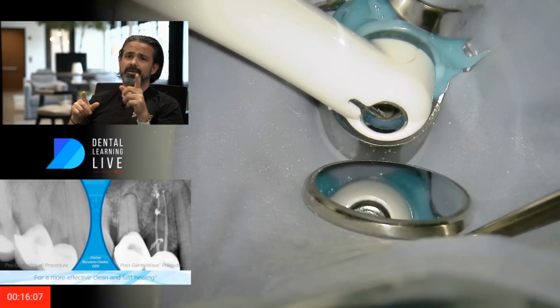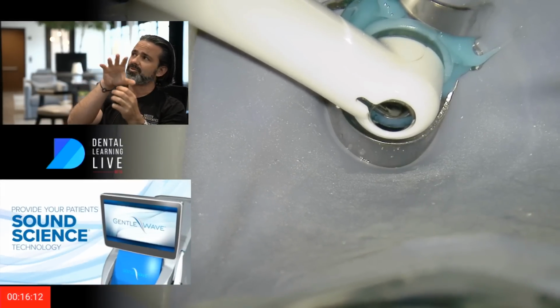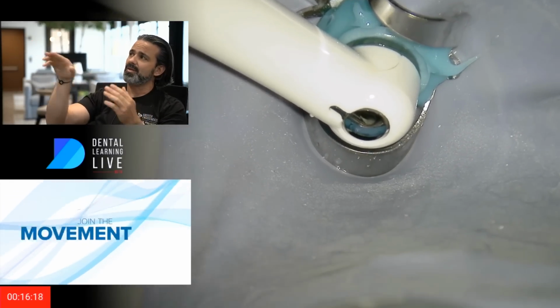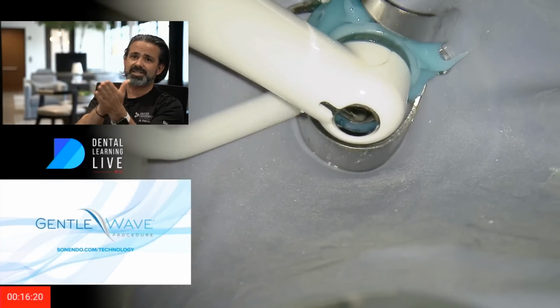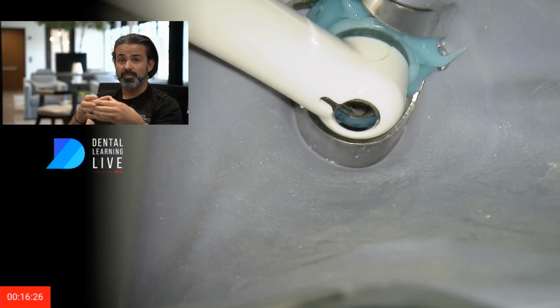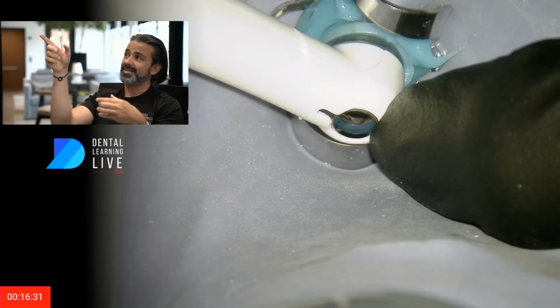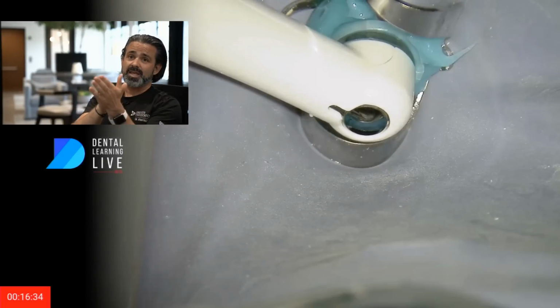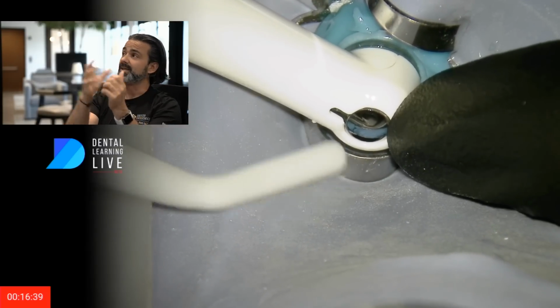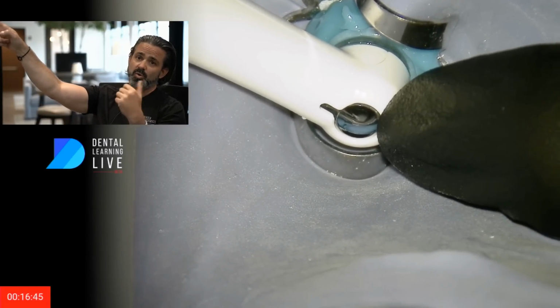Now, like I said, the fluid dynamics are going to be composed of several parts. You've got the sound flow coming through with these optimized fluids that come through the console, through the procedural instrument. And where the shear force of the fluid dynamics meets each other, instead of it being in the chamber, like it is with the molar procedural instrument, it's in the head of the handpiece. So that sound bar, think of it as inside. And that shear force is what we're seeing between the two fluids in a degassed environment, creating the cavitation cloud right there.